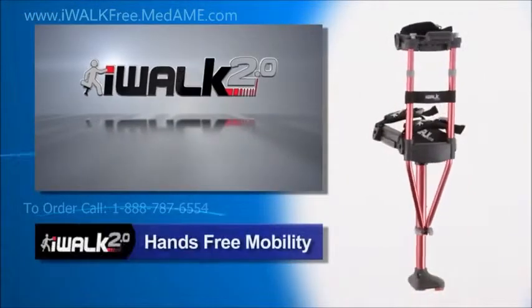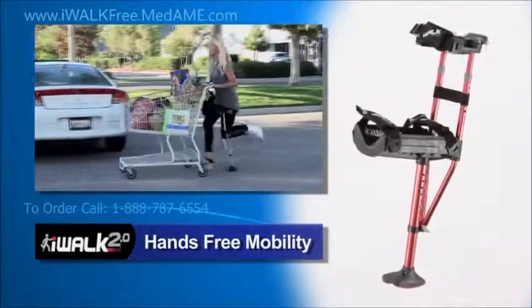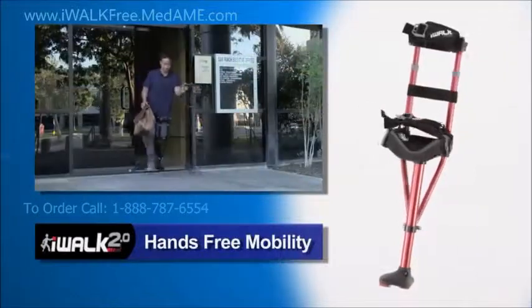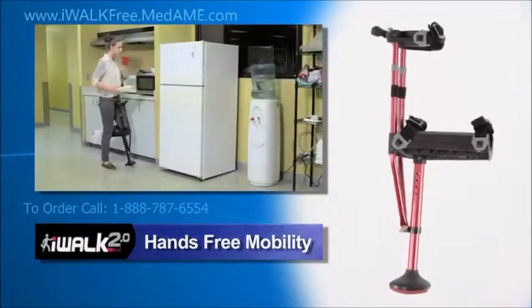The iWalk 2.0 is an amazing hands-free mobility device engineered to transfer the stress and strain of walking from your hands and wrists to your legs, leaving your hands and arms free to help you with the tasks of everyday life.